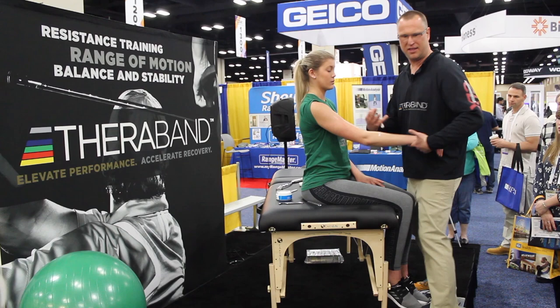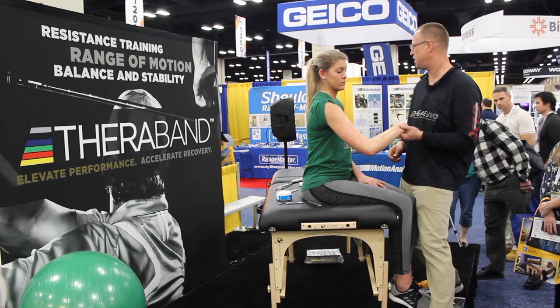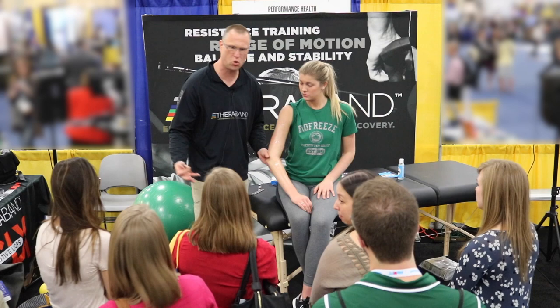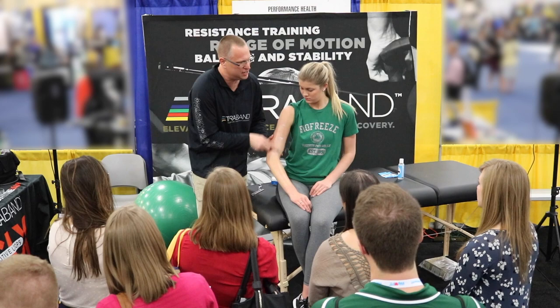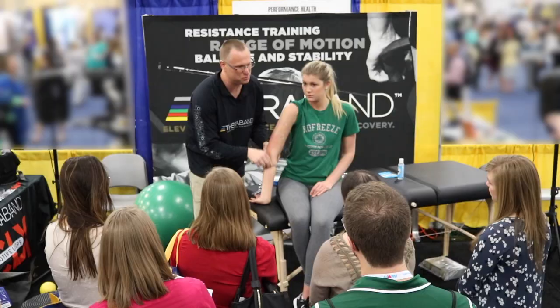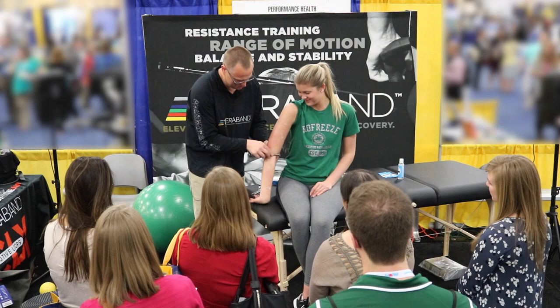I encourage the patient to relax. I would normally be in a position controlling the elbow, moving from extension with wrist flexion into more flexion to shorten the tissue — shortening the tissue allows me to go deeper. Understanding physiology, the mechanics of shortening and lengthening tissue is key. I'll switch to a single-beveled edge, which feels sharper and more acute, and alter the tissue length, maybe putting her into a stretch position — and there's some good gristle right through there.